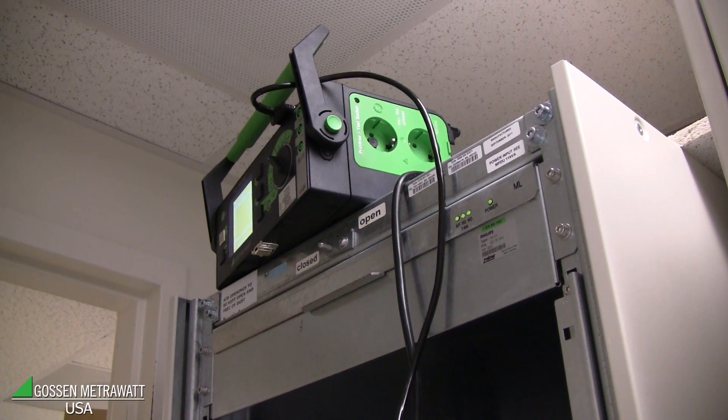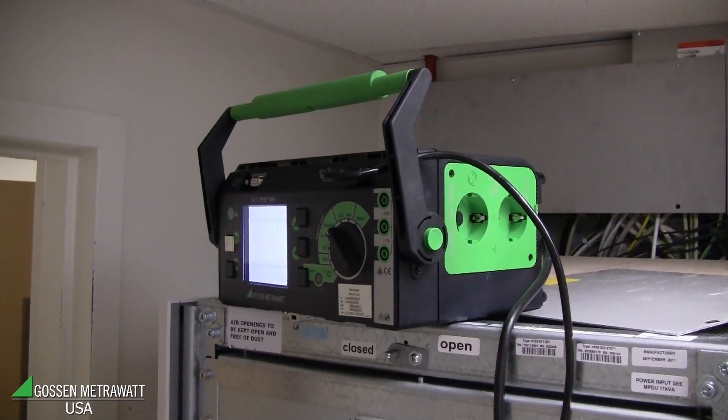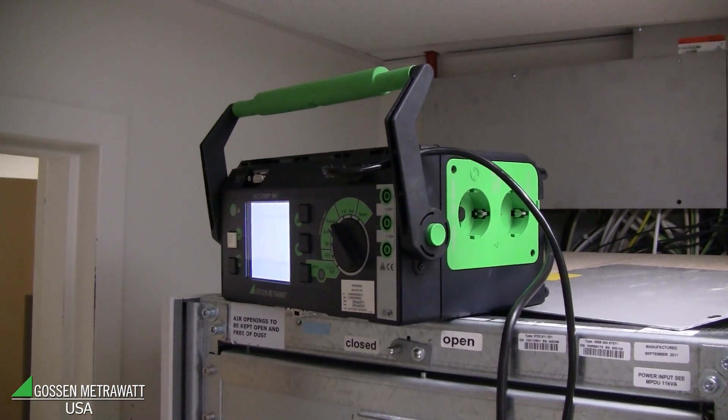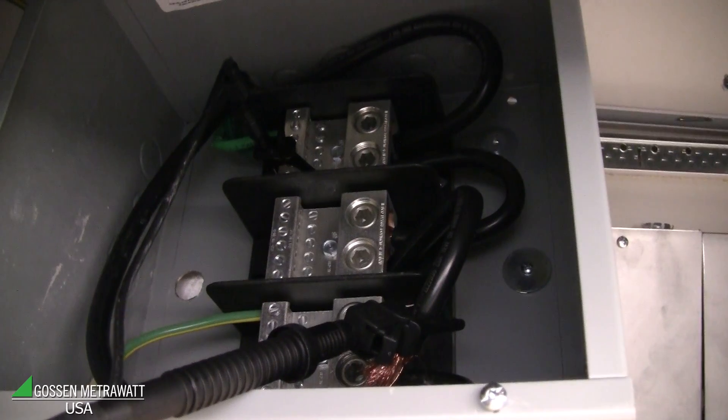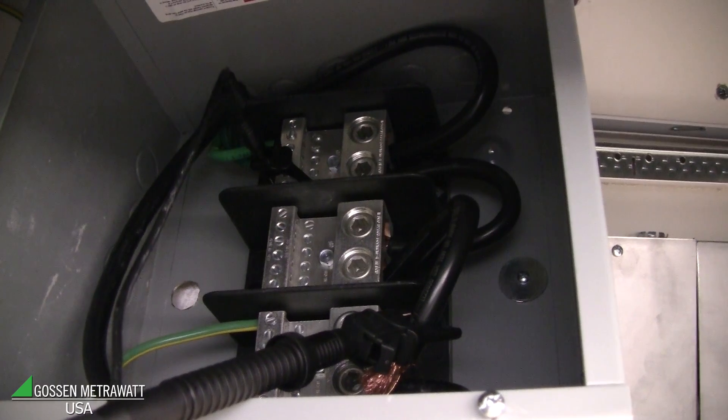Here we do an insulation test of the Philips equipment according to the building. For this reason, we make an insulation resistance test with 500 volt test voltage and we have to connect one probe with the building ground and another probe with the Philips equipment. Before we do this, we disconnect the connection which is normally between Philips and the building.